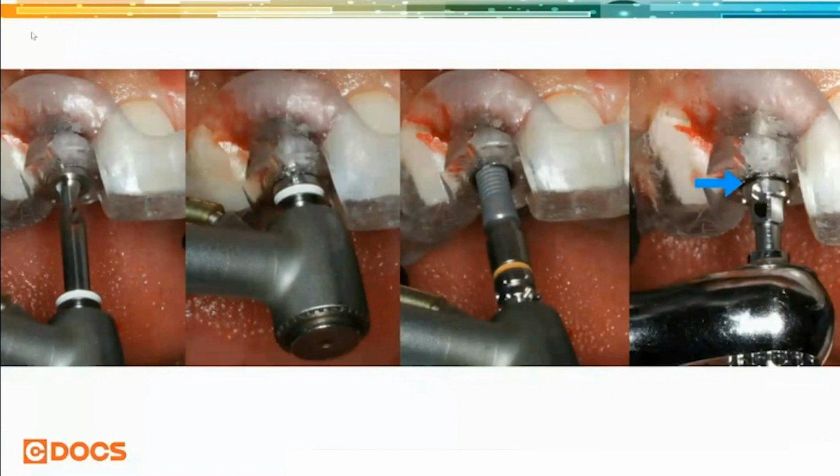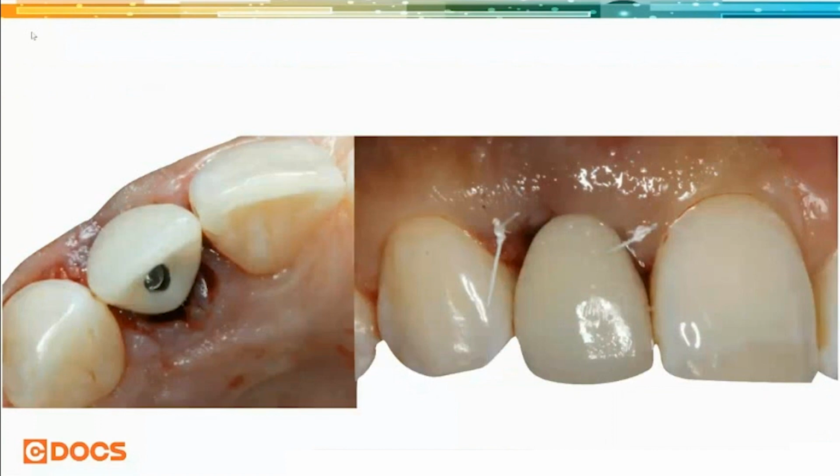And so it's critically important as we're doing EV guided surgery with the Azento system to make sure that the timing is perfect so that all the components that are pre-made will fit that implant. And that's kind of the one critical piece that we have to watch out for with this specific workflow.